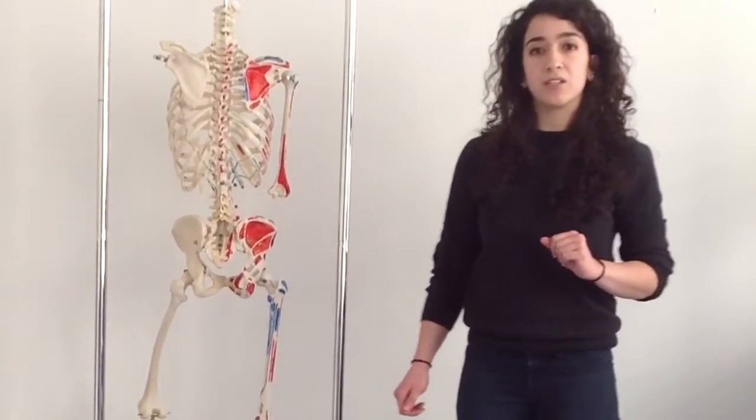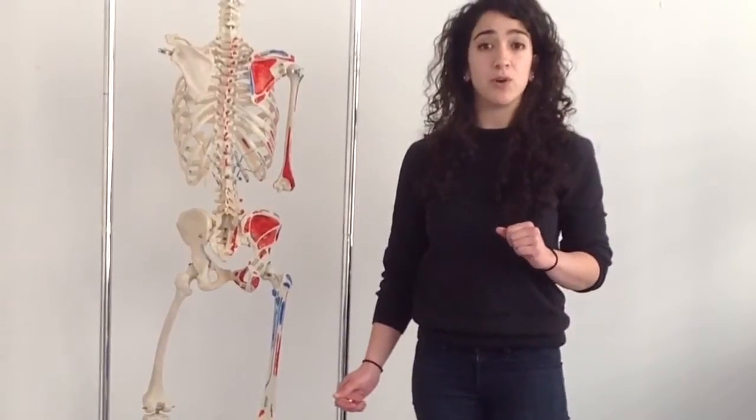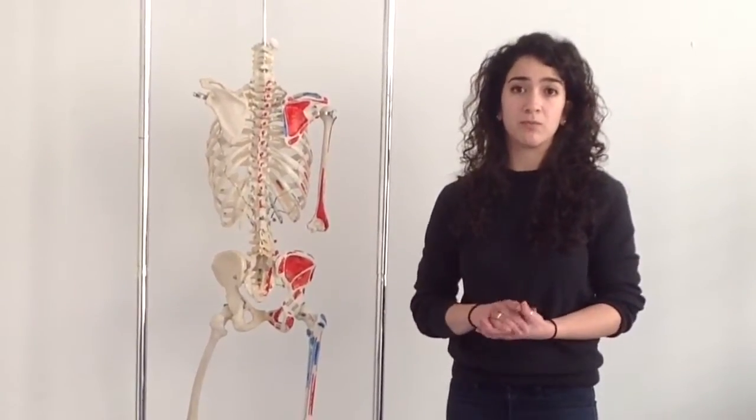Keeping that in mind, it is important to get a goniometric measurement of your patient's range of motion in order to have a baseline to compare to as your treatment progresses and to see how your patient is improving.